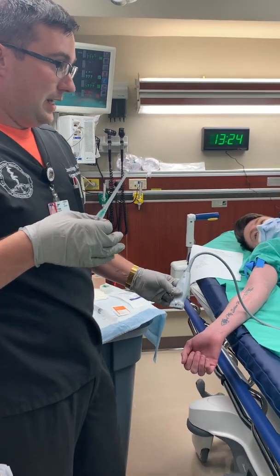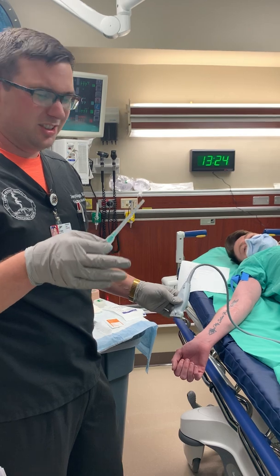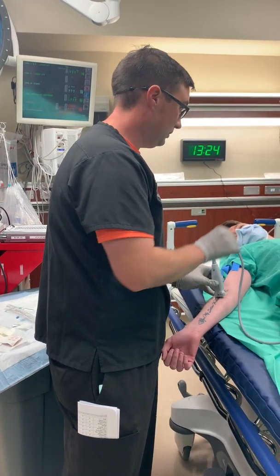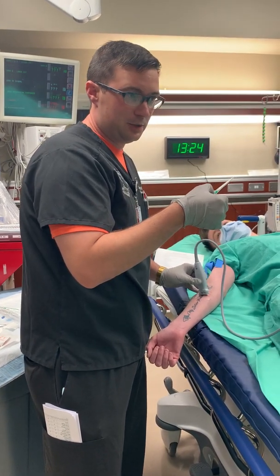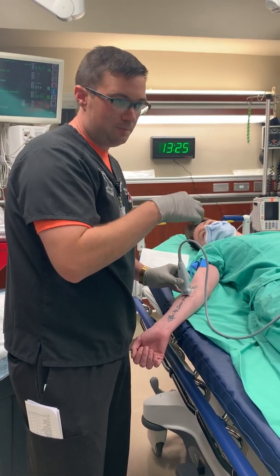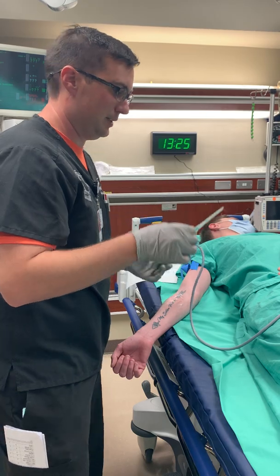Doctors and nurses both struggle with ultrasound-guided IVs in different ways. Doctors don't know how to handle the catheter. Nurses, on the other hand, are very good with IVs and always look for flash. If you look for flash, what will happen is you'll look away from the ultrasound, see the flash, and when you look back you can no longer find your needle tip. Because of the ultrasound gel making everything slick, you'll inadvertently puncture through that vessel and won't be able to find the needle tip. So don't look for flash. The first time I look down is once I've already taken the needle out.